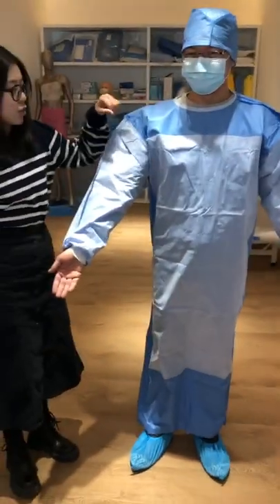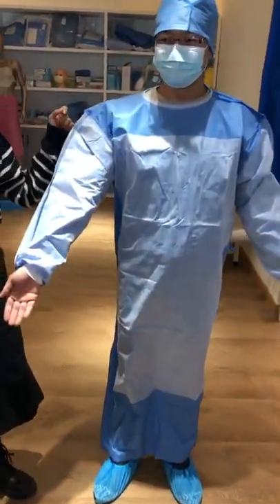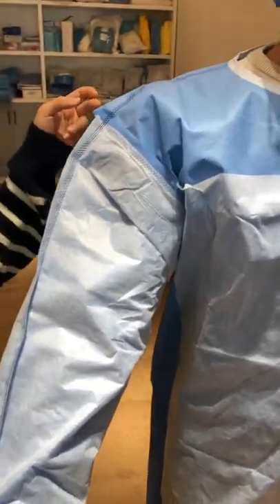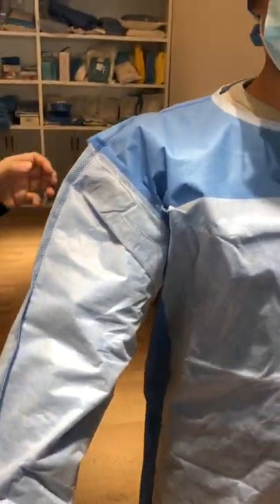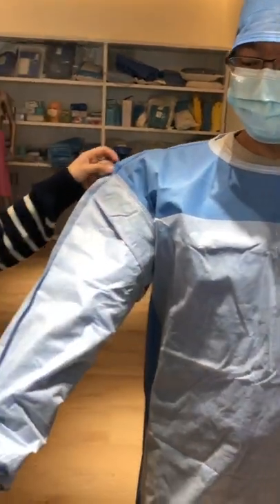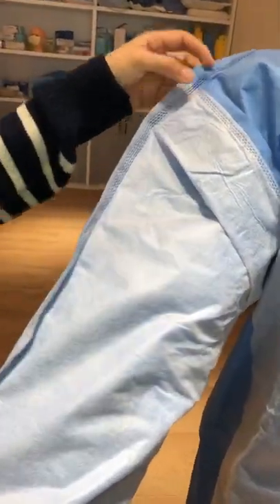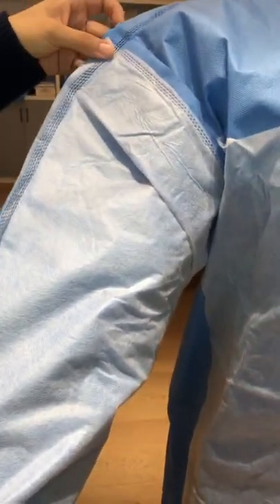This surgical gown is normally used for the OT theater. Let me show you the details — there is a reinforced part in the sleeves and the front side.